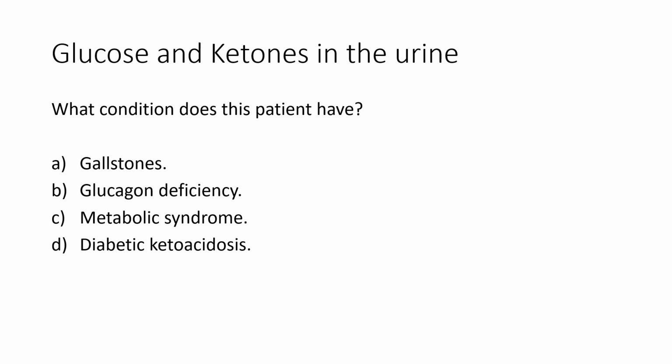So if we're not metabolizing glucose, and we are metabolizing fat, what do we think this patient has? Do they have gallstones? Do they have a glucagon deficiency? Is it metabolic syndrome or is it diabetic ketoacidosis? Well, this patient has diabetic ketoacidosis.